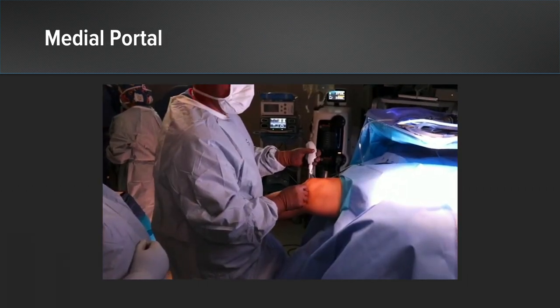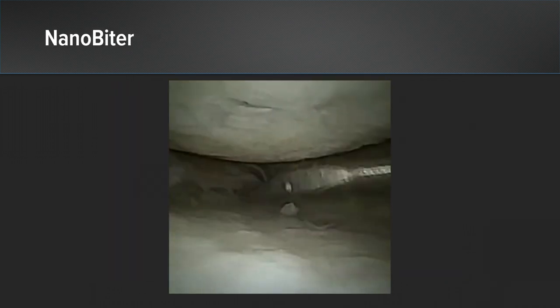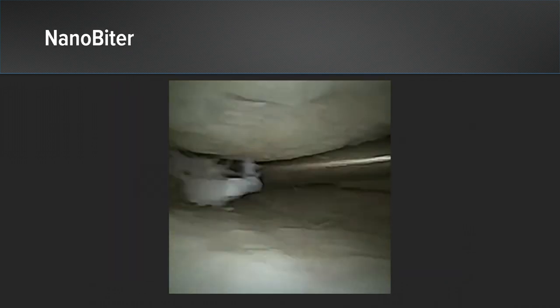Here you can see we establish a medial portal with a percutaneous approach using a spinal needle and a guidewire. We start our partial medial meniscectomy using the NanoBiter.